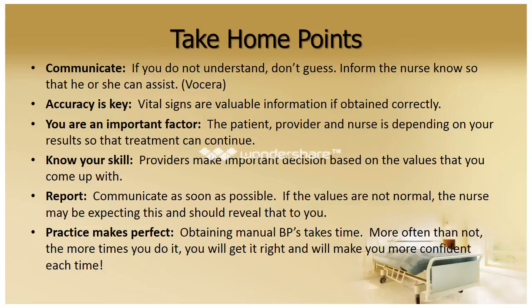Not necessarily so that you can do something about it, but definitely so that you're not alarmed when you do see these results. And try not to get into the practice of telling the patient that they have a low blood pressure or extremely high blood pressure. This may make them a little bit more nervous, and then we don't want their mood or their anxiety to increase or change the value of the blood pressure and the heart rate.